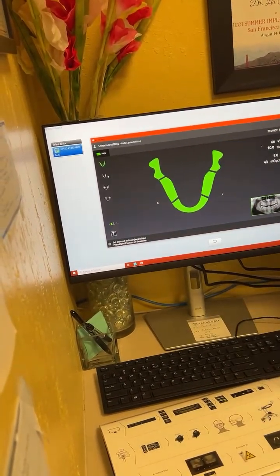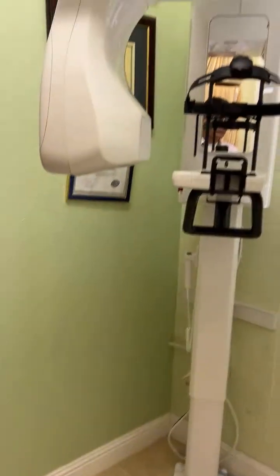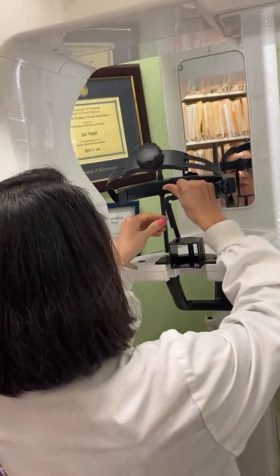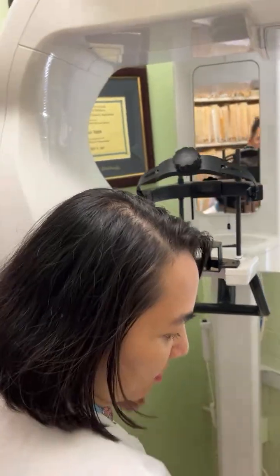Adult panoramic. Okay, so now it says set the chin rest to the right position, right? Okay, go ahead and do that, because that's not right. Don't put the patient in. No, we don't use that. We're going to use the bite stick. That would be one of those.